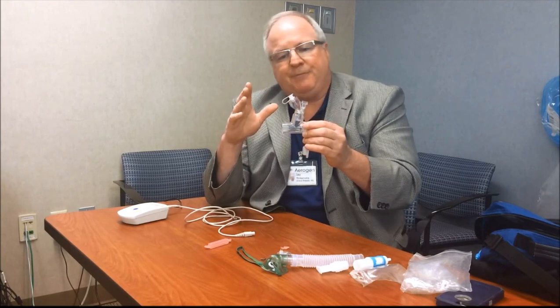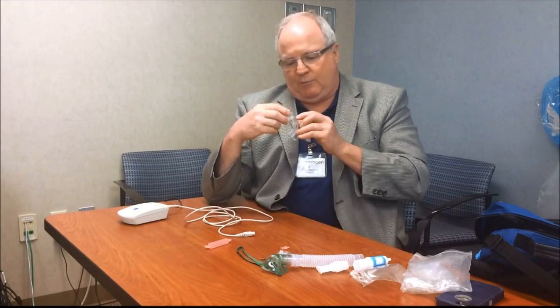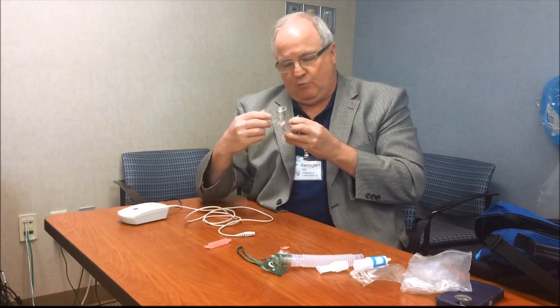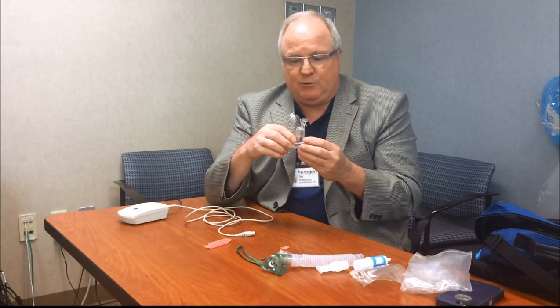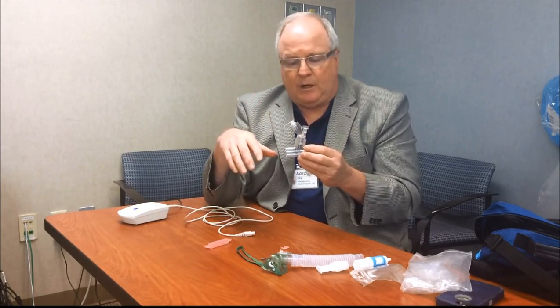Now if you had this in a different position, say in the circuit where the patient was up like this, you can then rotate this around because it is a friction fit, so you have the ability to rotate it to get the desired position. Once you are in the circuit, you can leave it in the circuit. You don't need to take it out in between treatments, thereby avoiding any loss of PEEP or airway pressure.